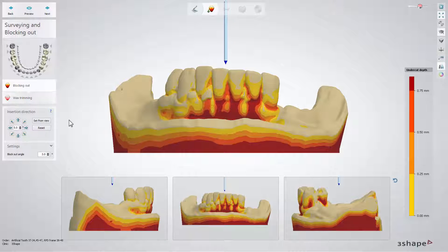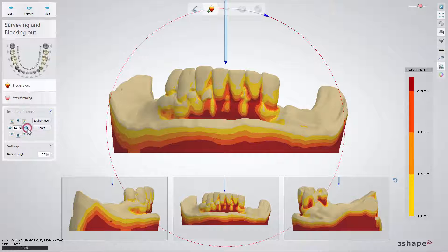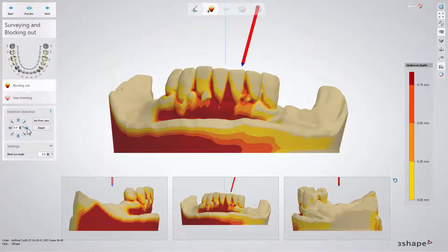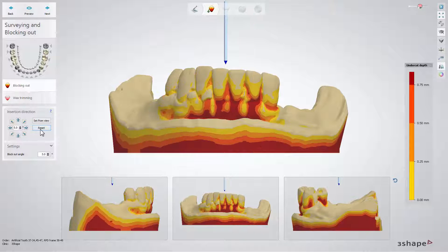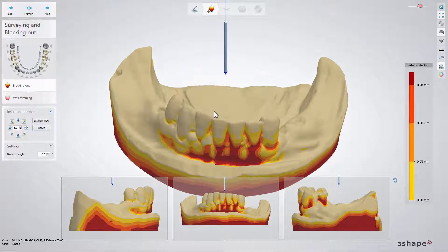At the surveying and blocking out step, you are able to block any undercuts caused by a chosen insertion direction. The software will automatically offer you a zero tilt insertion direction. If necessary, it can be changed with the help of blue arrows, or alternatively, with the Set from View button.